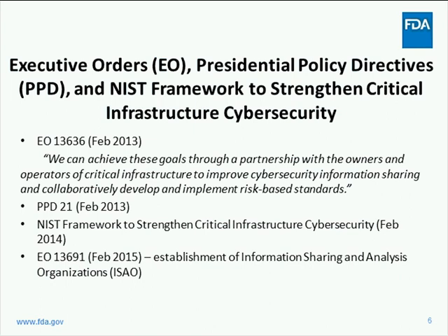Let's take a few moments to step back and contextualize FDA's policy and approach to medical device cybersecurity within the broader national architecture. In February 2013, the President issued Executive Order 13636. And I highlight for you a key statement from that order that in essence encapsulates the direction that our agency has taken. We can achieve these goals through a partnership with the owners and operators of critical infrastructure to improve cybersecurity information sharing and collaboratively develop and implement risk-based standards.